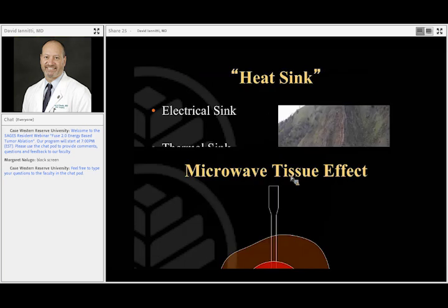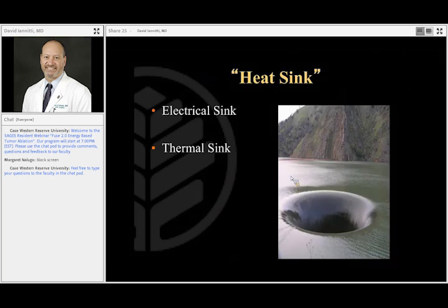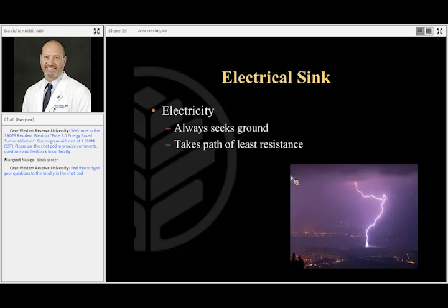So now the term heat sink gets thrown around a lot, and there's lots of misunderstanding, so I'm going to explain that really quick. There isn't something called a heat sink. It's either an electrical sink or a thermal sink or both. Well, what's an electrical sink? As I mentioned, if you understand electricity, electric current is very simple. It always does two things. It always seeks ground, and it always takes the path of least resistance. Super easy physics.